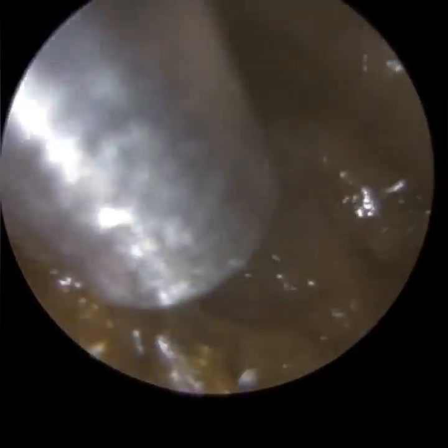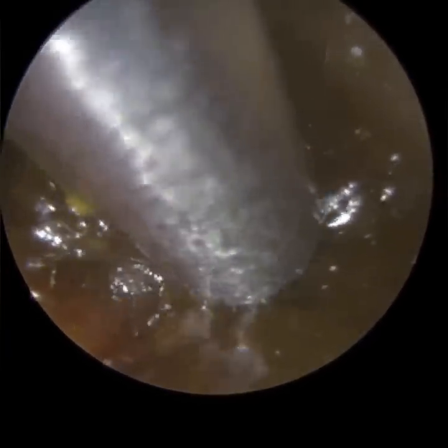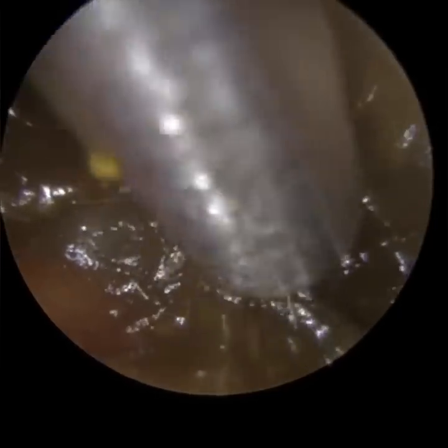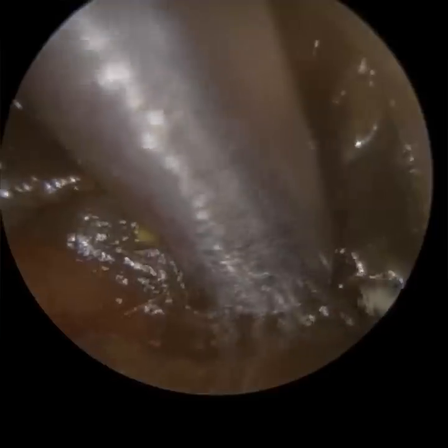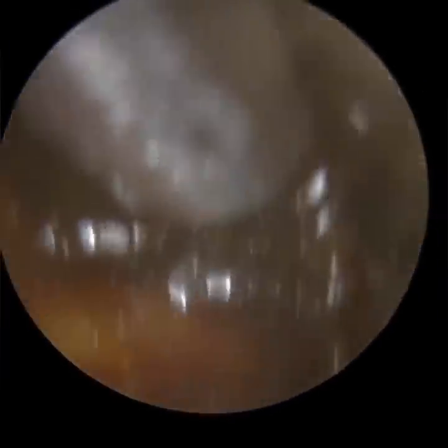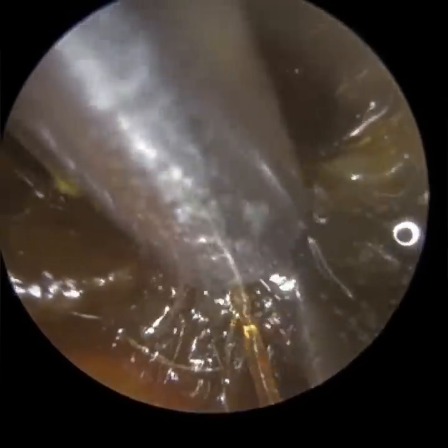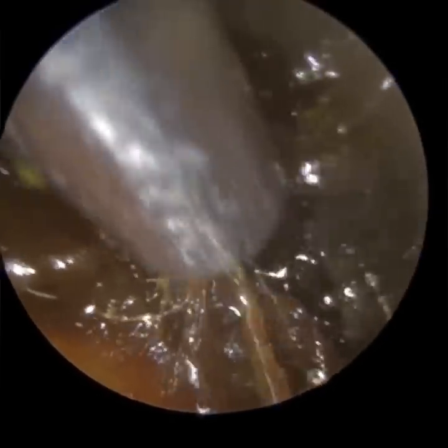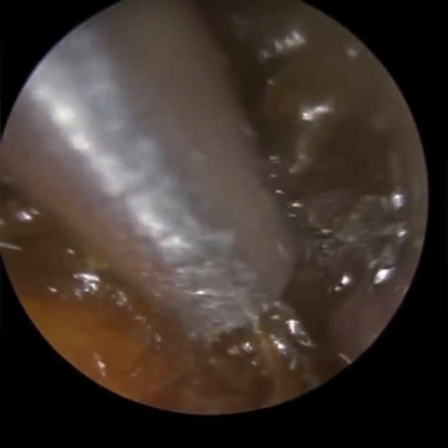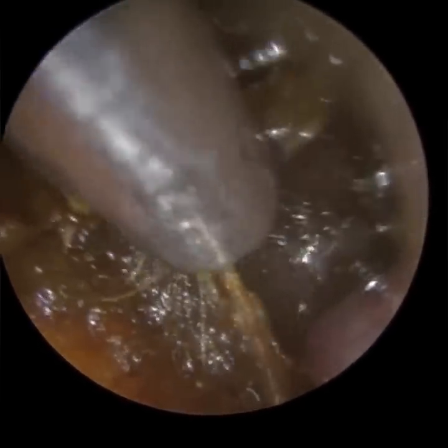I've grouped a couple of patients together in this compilation video because they both suffer from a condition called tympanosclerosis, and more specifically, myringosclerosis. I'll explain what myringosclerosis is and how it somewhat differs from the normal term tympanosclerosis. I want you to look carefully at the wax itself – I will disclose what I'm referencing a bit later, so see if you can identify something within the wax itself before the end of this patient's procedure.